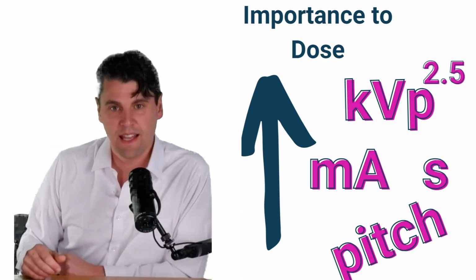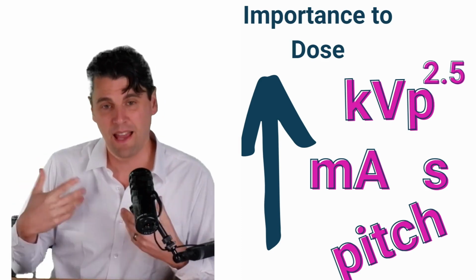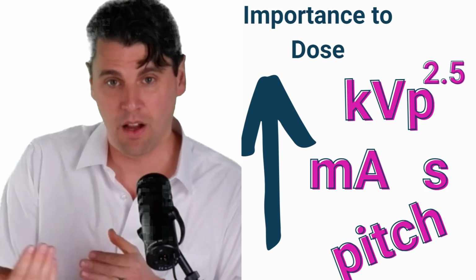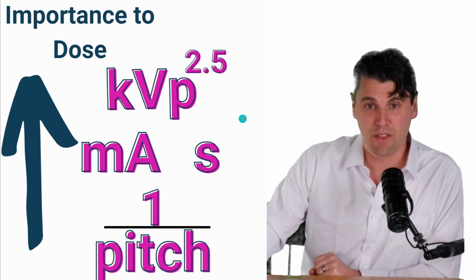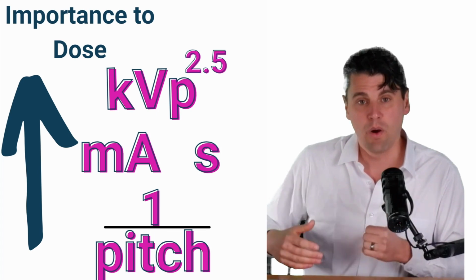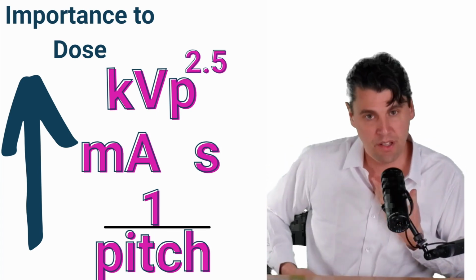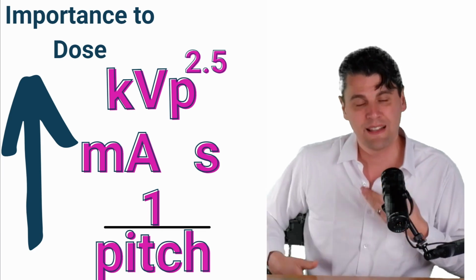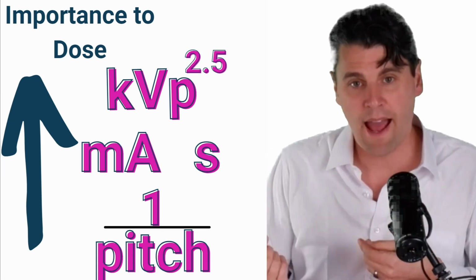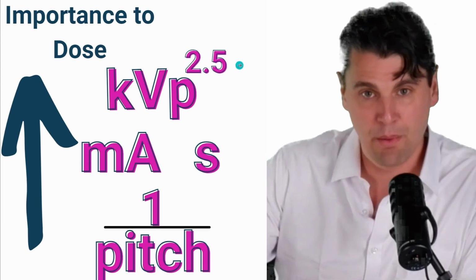Just like in X-ray, those are directly proportional to the dose, because the mA is how many photons we're making in a given amount of time, and the time is how long the patient is being exposed. The pitch is actually inversely proportional. As the pitch gets higher, we're making fewer redundant measurements, so we're not depositing as much dose. If the pitch is lower, we're making more redundant measurements, and thus we're depositing more dose in the patient.